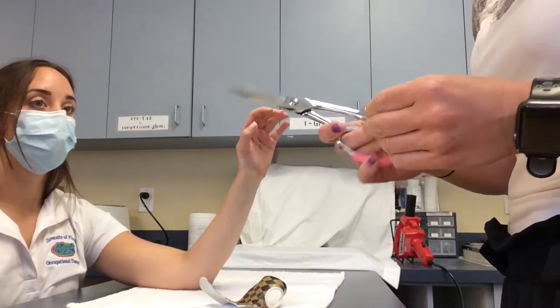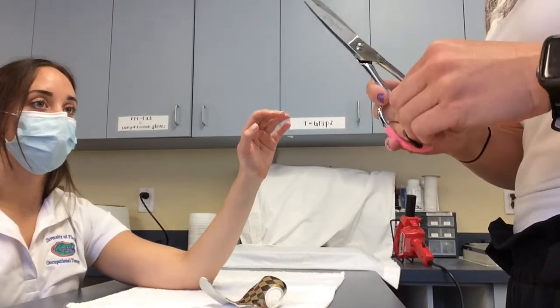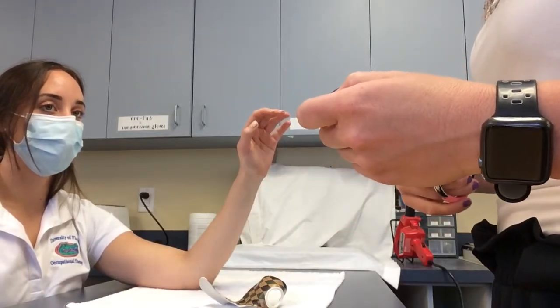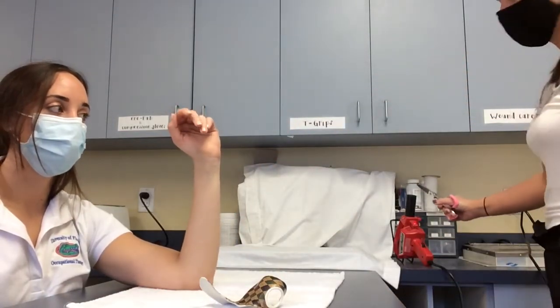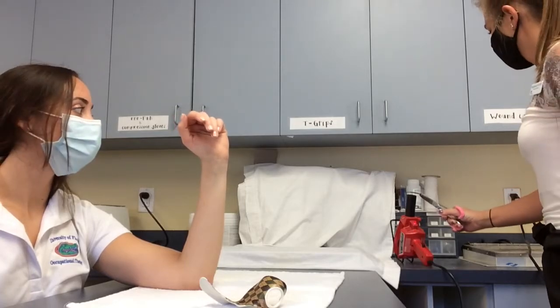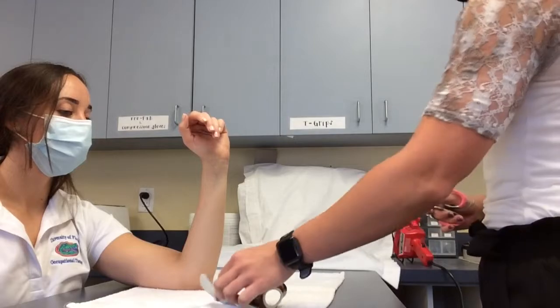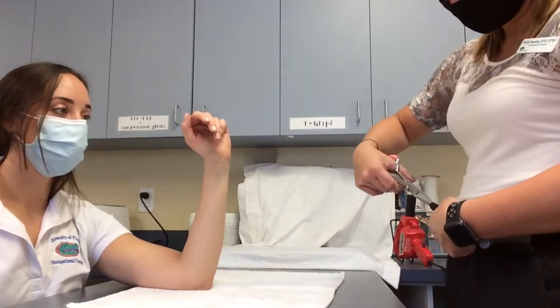Next, use the hook Velcro and place it along the volar aspect of the ring finger and small finger, as well as along the palm of the hand for strapping. Again, there are other ways to Velcro and strap — I chose to do it this way. Using a heat gun to heat up the Velcro will also allow the material to stick better.